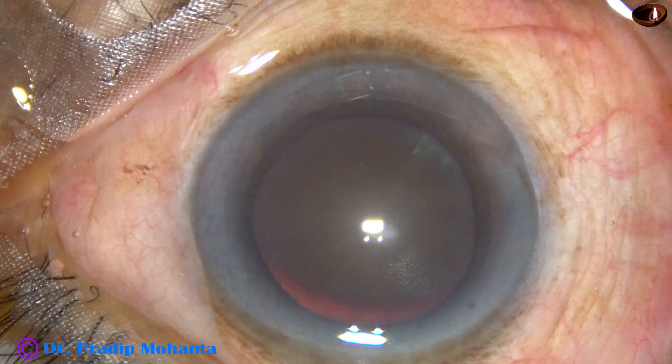This is a cataract with grade 5 nuclear sclerosis. In this case I will demonstrate nuclear division by submarine chop.